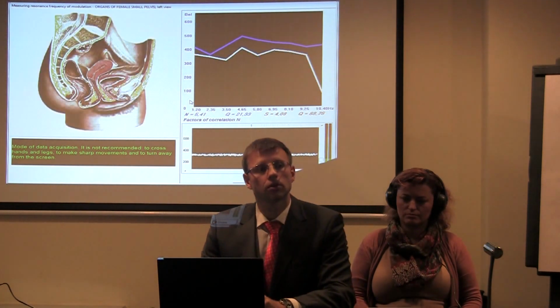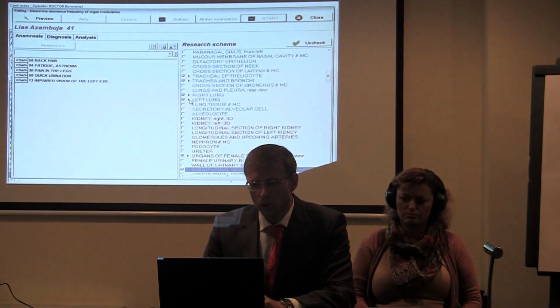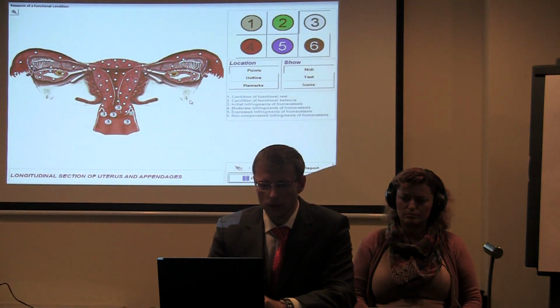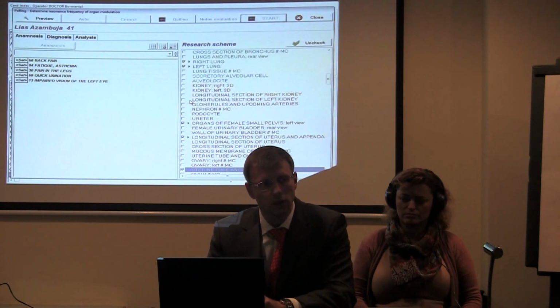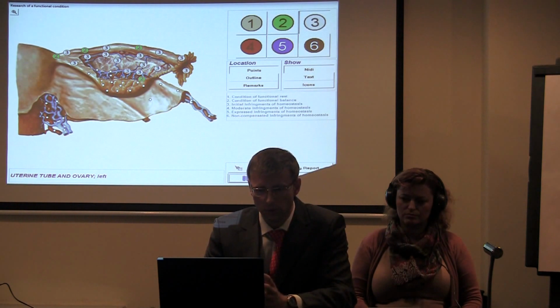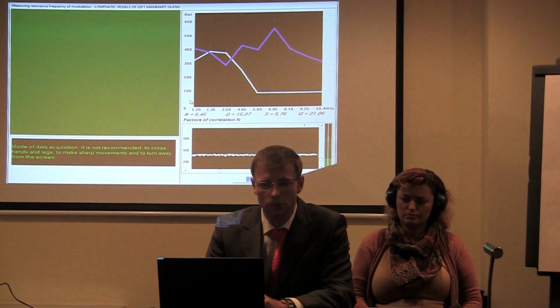So 6 doesn't necessarily correlate with diagnostic tests done by conventional medicine. The main test is making a special analysis of the organ, where you will see later a list of diseases with a special coefficient, and we work with this coefficient. These marks are just to motivate the person, not to make him believe, but to make him see and think that he needs some help and some treatment.